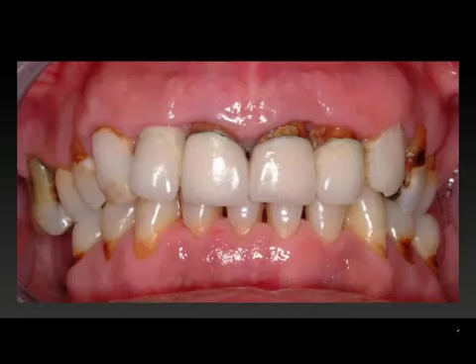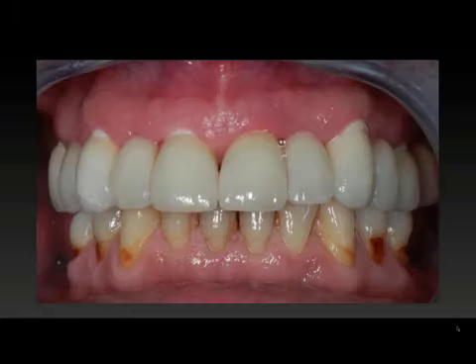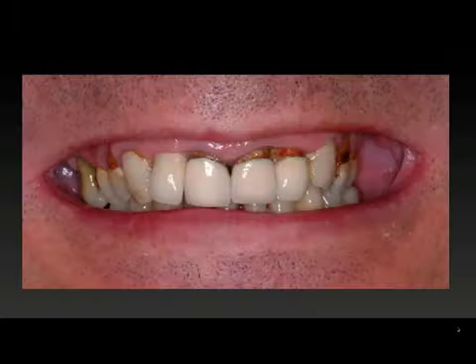This last case I'm going to share with you is a more advanced case in a periodontally compromised patient. We are able to rebuild arches. We need a good solid foundation of bone, and this again goes back to what cases are indicated for ceramic implants. Something like this where we have failing dentition, or we have adequate bony structures, we can rehabilitate using multiple ceramic implants. This was the case again, preoperatively and correctly treatment planned.